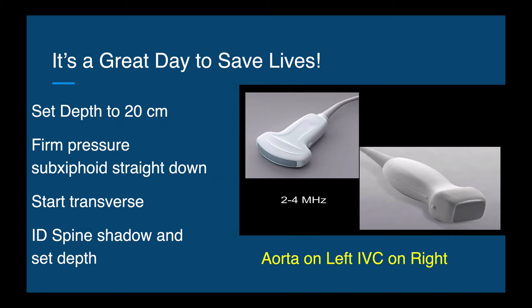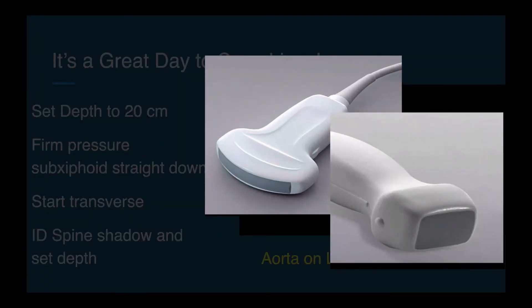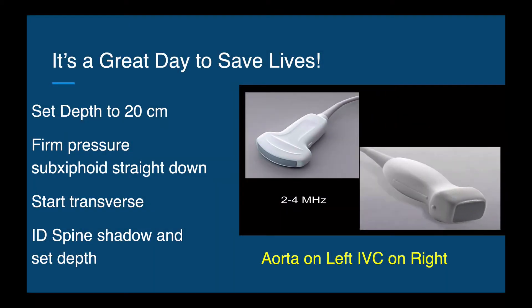We're going to use a curvilinear or phased array probe and set our depth to 20 centimeters. We will exert firm pressure just below the xiphoid and aim the probe directly perpendicular to the skin towards the back. We will start out transverse with the marker dot to the patient's right side and identify the spine shadow as the deepest structure, setting our depth one centimeter deep to the spine shadow. On the left we will see the aorta; on the right, the inferior vena cava.